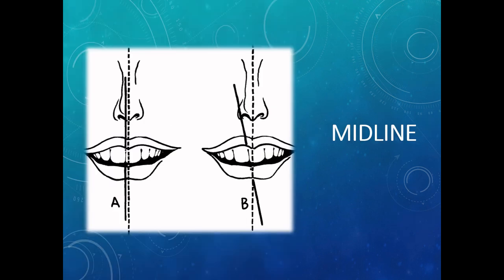Next is the midline, which we have already discussed, that the facial and the dental midlines should coincide. But usually the features of a face slant one way or another, and it is rather difficult to see a true midline in a dentition. It is usually more eccentric than is noticed. Therefore, an eccentric midline in a denture, if not too exaggerated, is acceptable and may give the illusion of a natural dentition. And the mid-axis of the central incisors should be vertical to the incisal and occlusal plane.